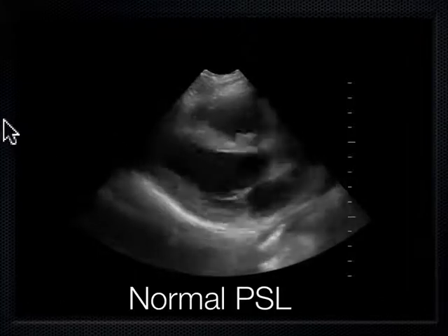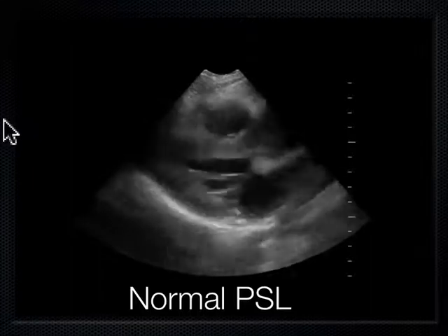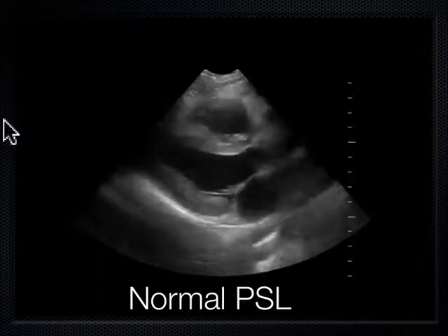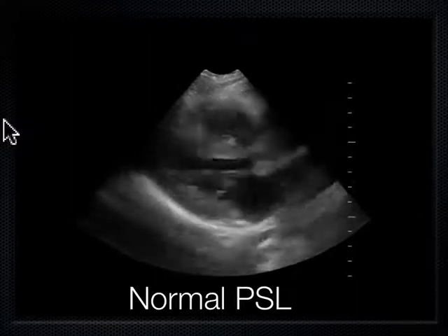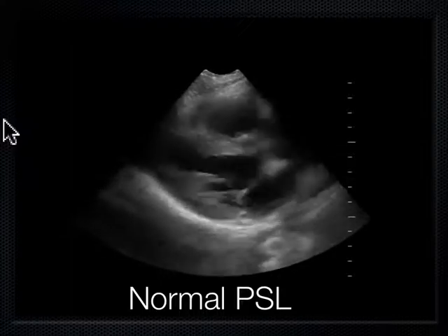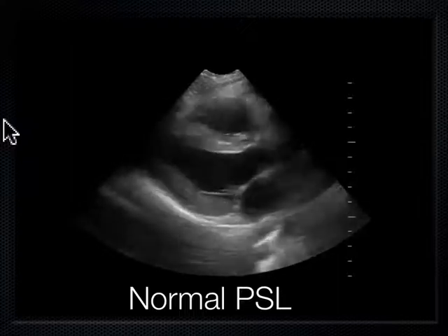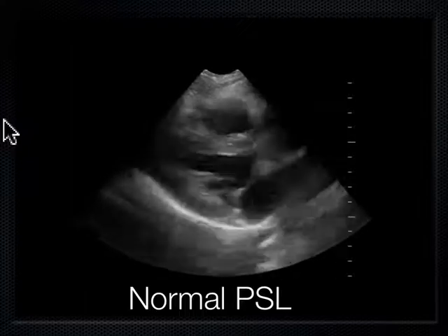And so what I do clinically is, if I have a patient who's got hypotension and I am trying to resuscitate them, I break hypotensive patients down into, do I give them fluids? So if a person comes in my ER and their blood pressure is 70/40, how do I get their blood pressure back up? I can give them fluids. That's kind of my knee-jerk response. And if I saw a normal functioning left ventricle like this, yeah, I could safely give this person fluids, and that would probably fix their hypotension.